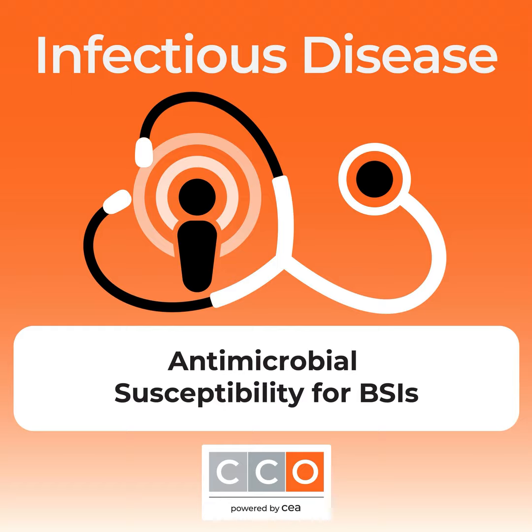So when we have a KPC, meropenem-vaborbactam is the drug of choice. When we have a metallo-beta-lactamase in Enterobacterales, ceftazidime-avibactam plus aztreonam is the drug of choice. And we have OXA-48. The current epidemiology of metallo-beta-lactamase and KPC is changing in the US, so identification of the gene is critical. And this is one of the advantages of the BCID.